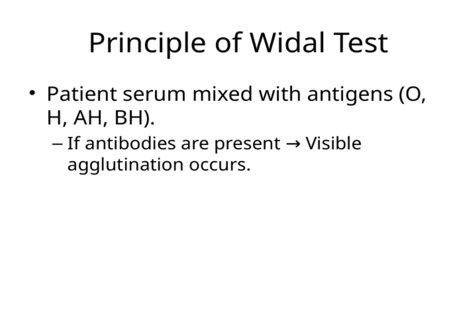So, in simple terms, the principle of the WIDAL test is based on detecting these specific antibody-antigen interactions. If we see agglutination, it suggests that the patient has been exposed to the pathogen and has produced antibodies against it. This is how the test helps us diagnose infections like typhoid fever.